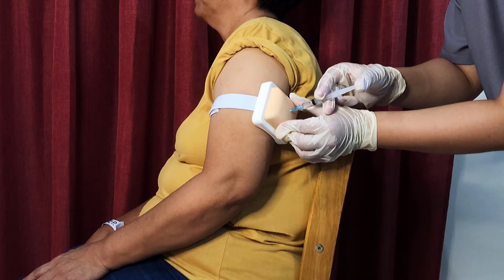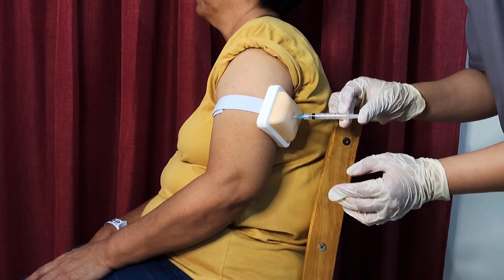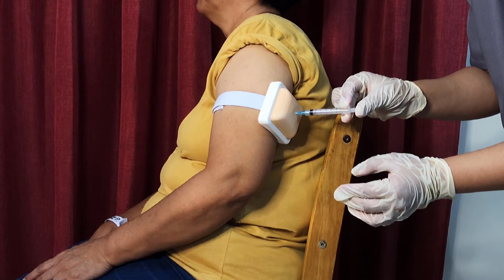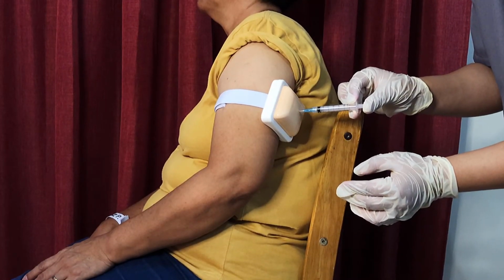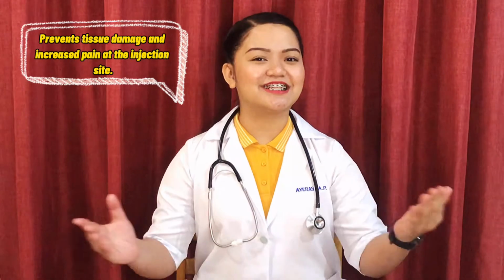After the needle is in place, release the tissue. And with your dominant hand, inject the medication at a rate of 10 seconds per ml. And yes, avoid moving the syringe. Keeping the needle steady helps keep the needle in place. And then, withdraw the needle quickly at the same angle at which it was inserted. Withdrawing at the same angle prevents tissue damage and increased pain at the injection site.